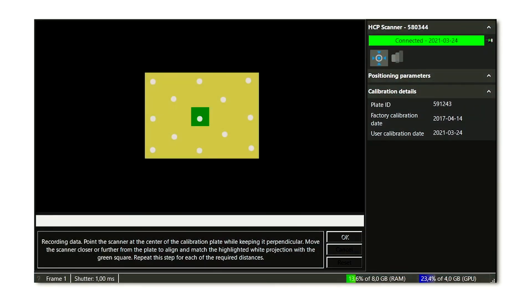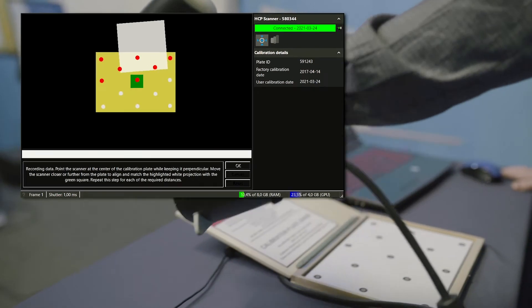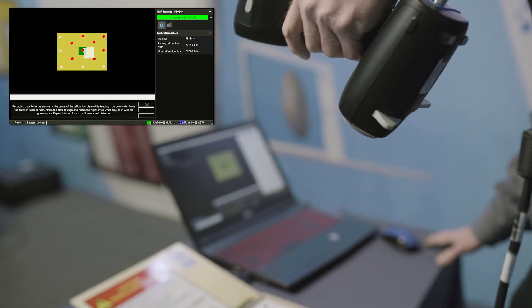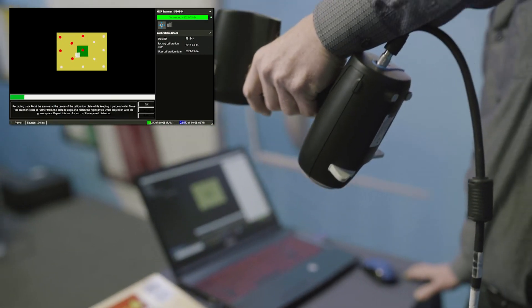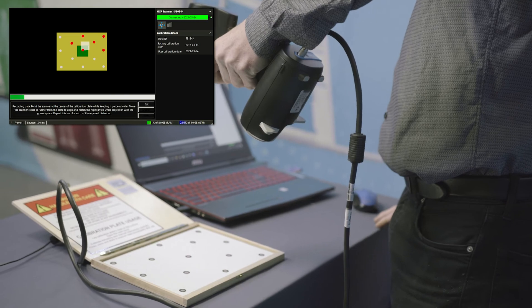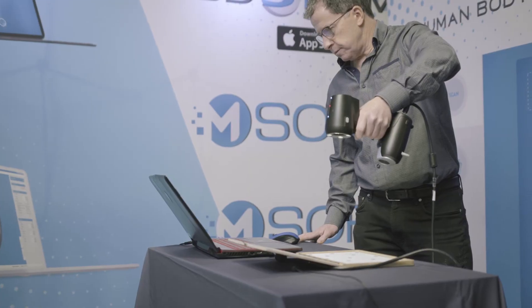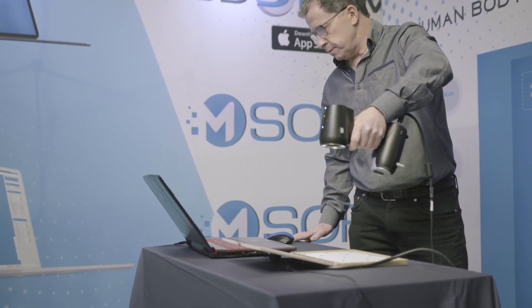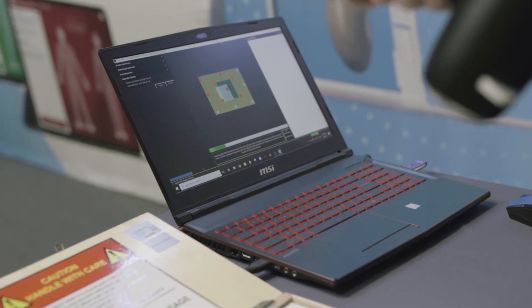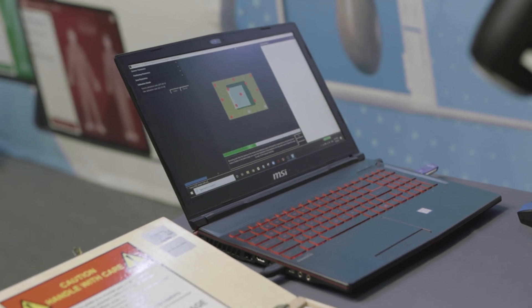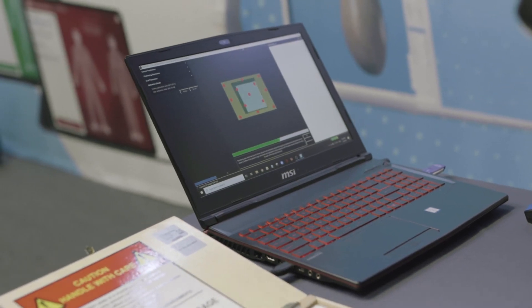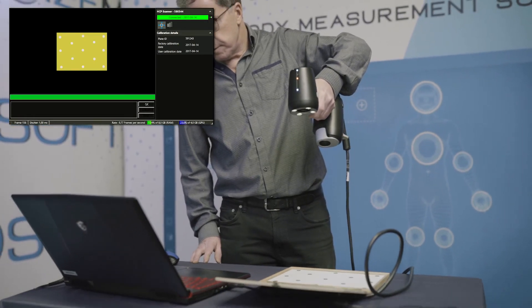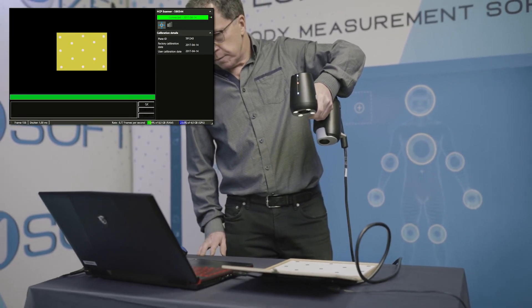When the calibration wizard opens, follow the instructions. Point the body scan scanner at the center of the calibration plate while keeping it perpendicular. Move the scanner closer or further from the plate to align and match the highlighted white projection with the green square. Repeat this step for each of the required distances.